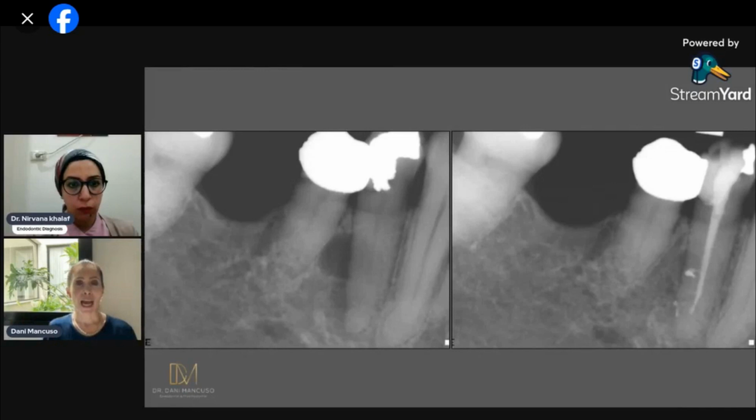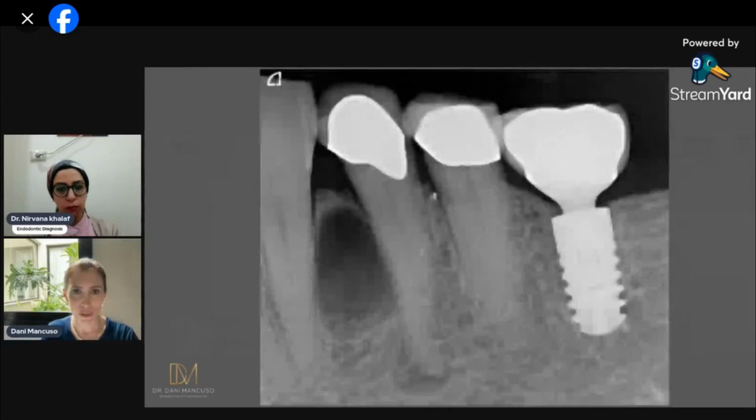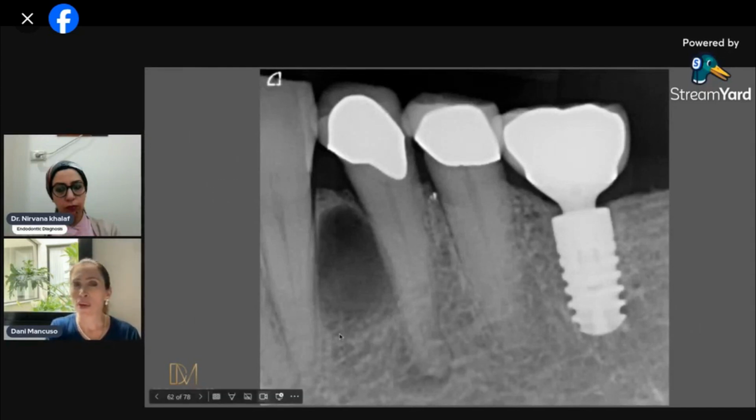then monitor. When you have radiolucency more interdentally, in this case, we could see that this was the problematic tooth and the root filling was more obvious. But what happens to that tooth when it's a lot larger and everything is so difficult for you to check? We are normally a bit scared of large radiolucencies. So pay attention. Of course, this tooth has a crown, is more likely to be the problematic one. There is an apical radiolucency, again, more likely.